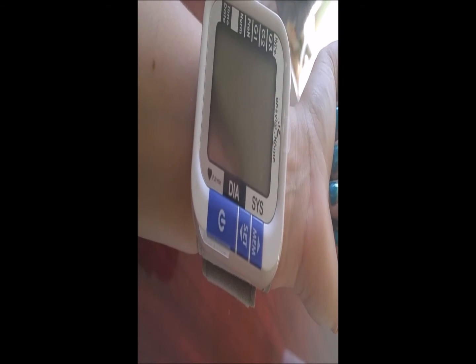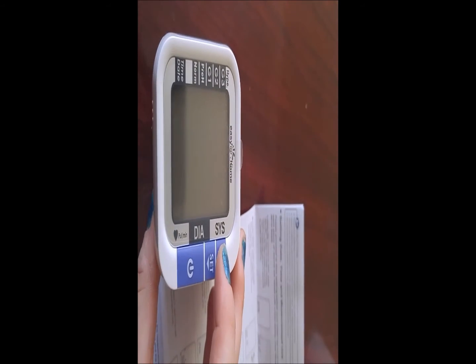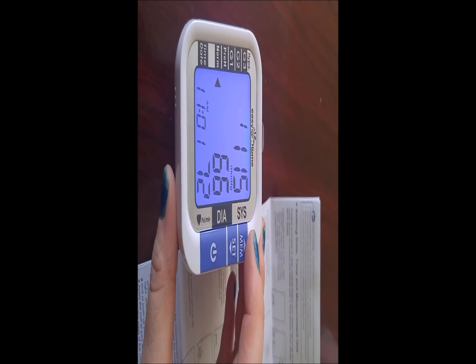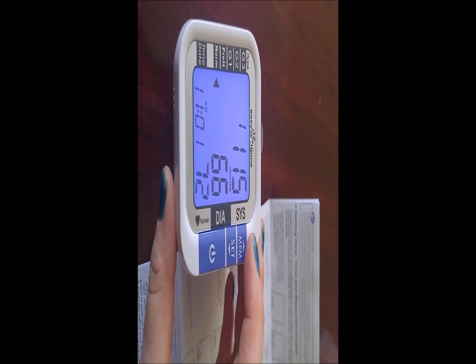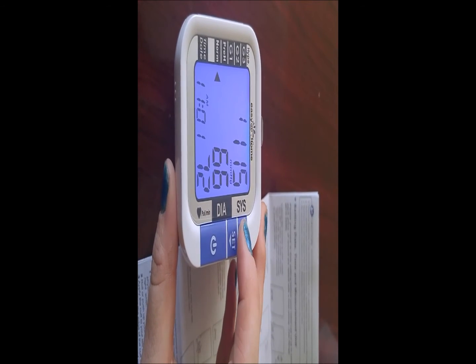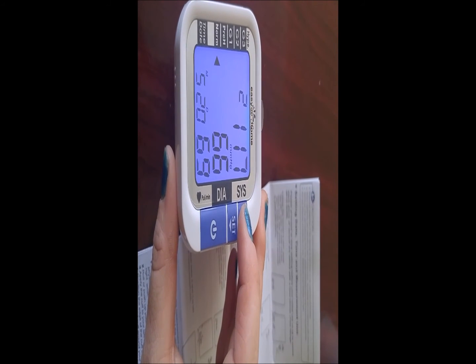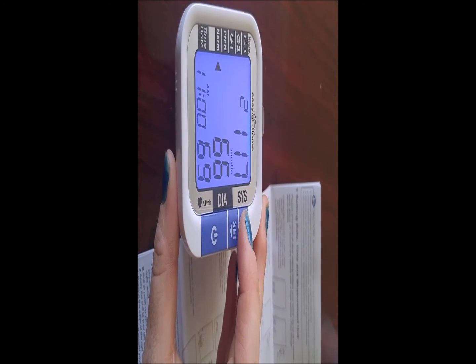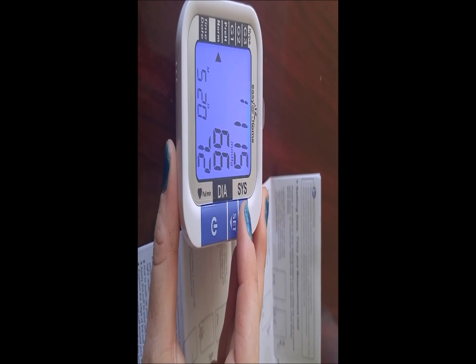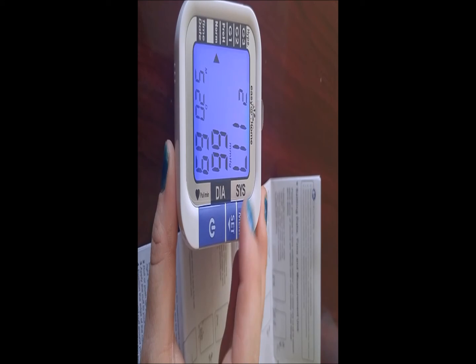Turn your unit off. Once the unit is off, we can check memory settings to see our previous readings. Select memory while the unit is off and you will see the date and time of each reading. The first reading was 5/20 — today's date — at 11:01 AM, and the second was 5/20 at 11 AM. So reading one, reading two — and you can see the numbers.